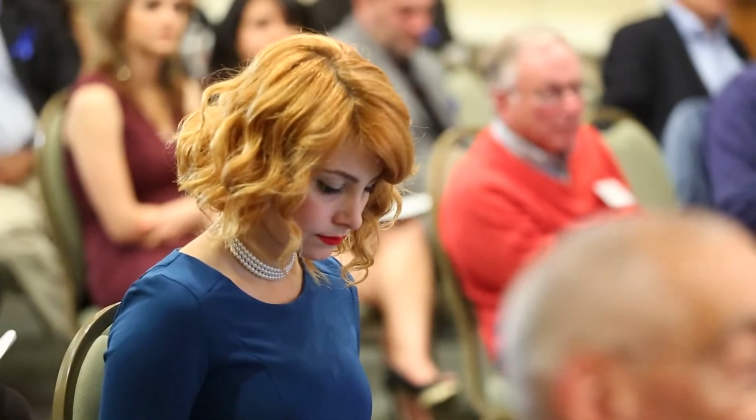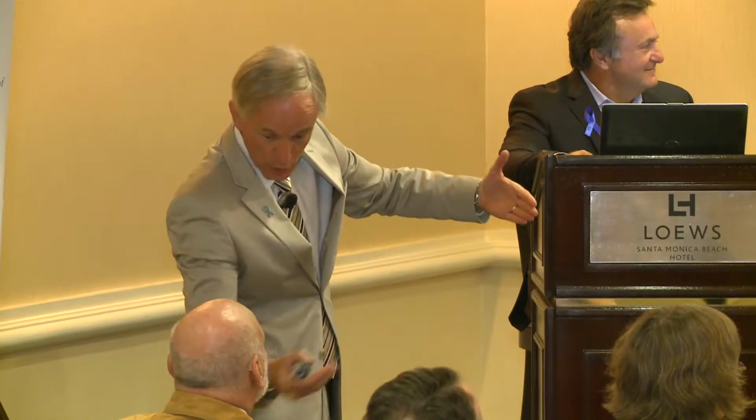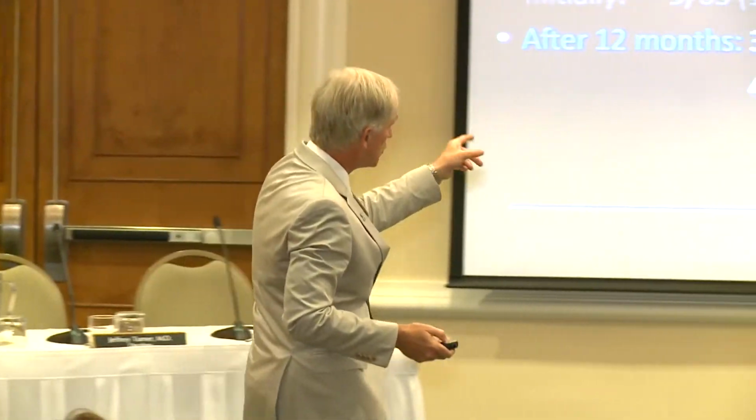What nowadays people do is they have a needle every year, or once in 2 years, to have your diagnosis assessed, but you cannot be quite sure. Now with MR imaging, you come to my office and I show you nicely, you see, there's no tumor. And after 1 year, you can see that there are no changes. Will you go home happily? Probably yes. If there is a change, however, we can stick the needle exactly to the point where the change is on the image.